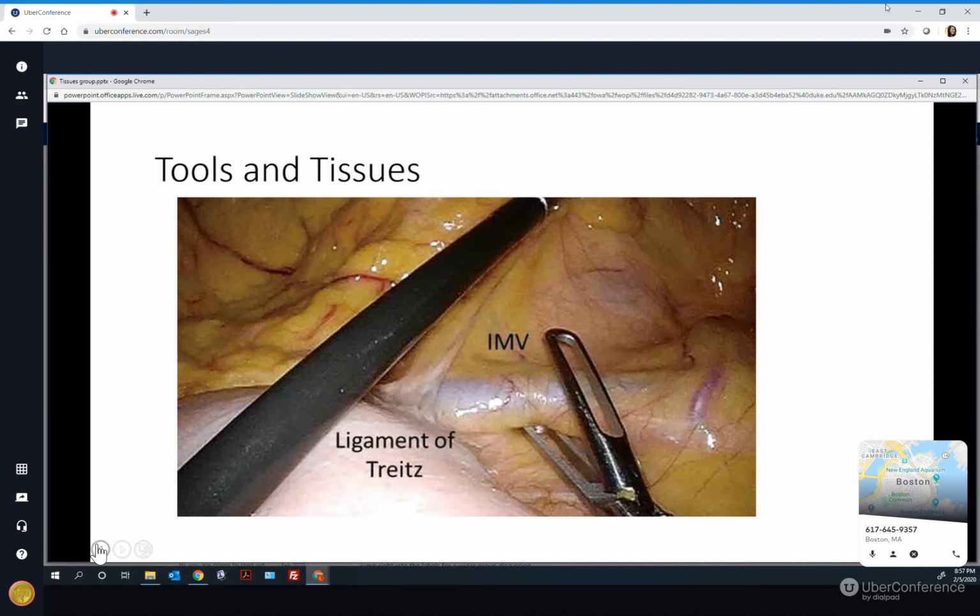I see a couple of instruments. One of them is a grasper, the other is something. There's some tissue on the lower border. I can't say what it is. So this is what I was thinking, and this ambiguity is what we will be left with if we focus a lot on the tissue characteristics with granularity.